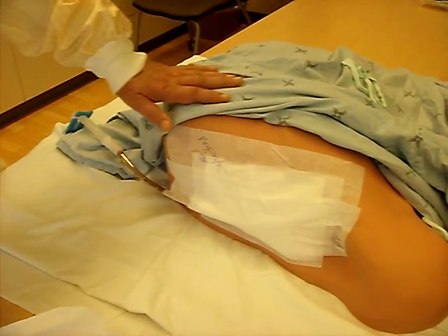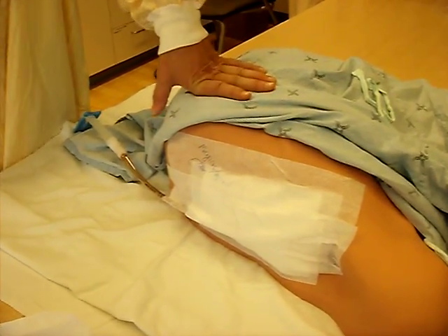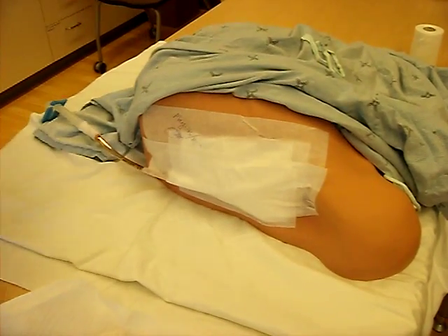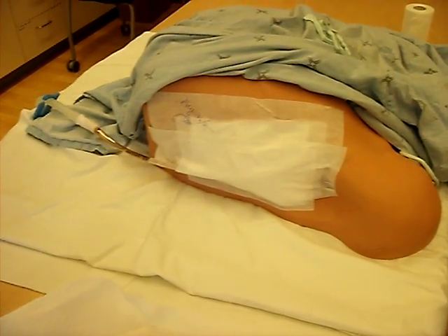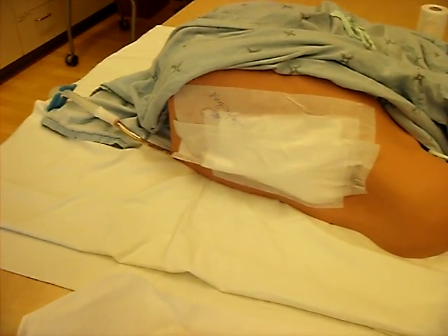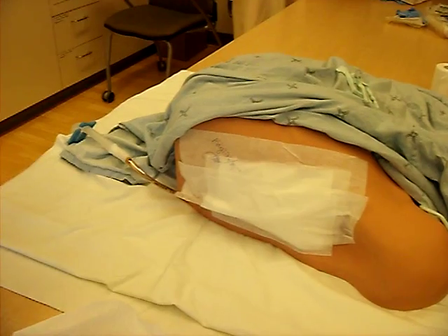Once you've done an assessment of the patient's chest, you want to chart that, obviously. You want to take O2 sats to make sure their perfusion is still satisfactory. That way you'll have a baseline for when you take the chest tube out, should that sat change. Part of that will also be making sure that the patient has some pre-education before you pull the chest tube. At this point, you're going to talk about the reasons for taking the chest tube out: your chest tube is now draining less, the doctor has ordered it out, and I will need you to cooperate as part of this procedure, so you will need to go through the breathing exercises with the patient in advance.